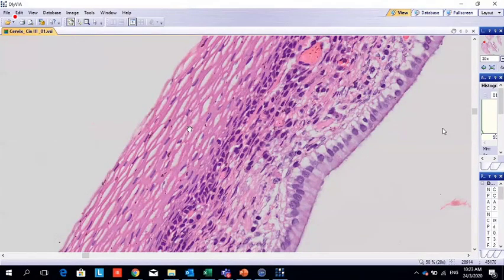So why do we like the Pap smear? The Pap stain gives different colors to the cells. The basal and parabasal layers give the blue color, and the intermediate, which are bigger cells, also give blue color. The outer cells are pink. So in Pap smear we can differentiate between the cells.